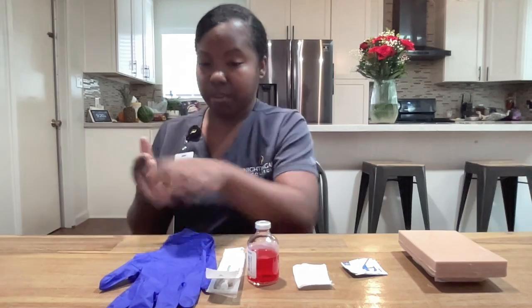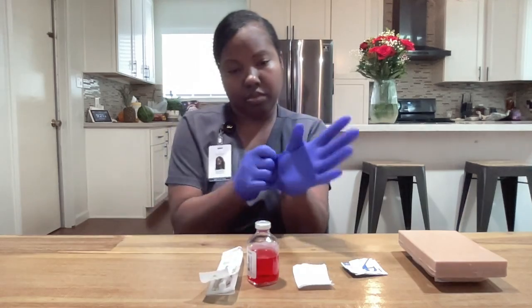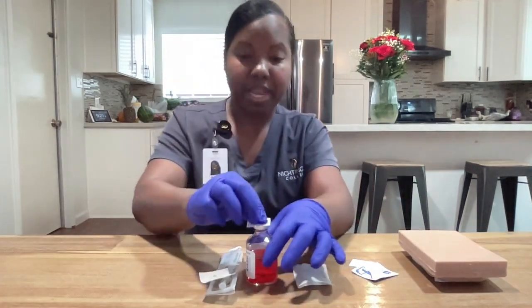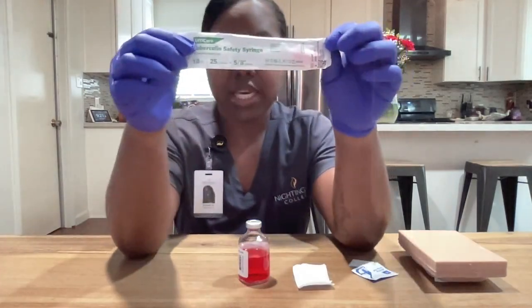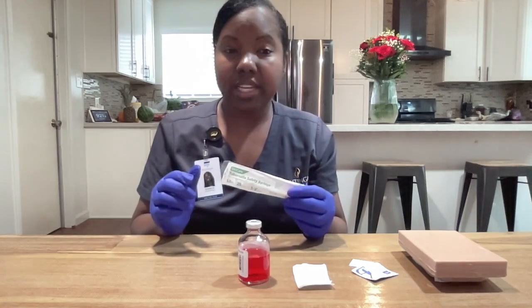Mr. Jones, I am going to start preparing the injection. I'm going to use this opportunity to verify my medication for the last time — my third time. I will perform hand hygiene and put on clean gloves. I will clean the top of the medication valve. Today I will be using the tuberculin safety syringe. This is a 1.0 mL syringe with a 25-gauge, 5/8-inch needle.